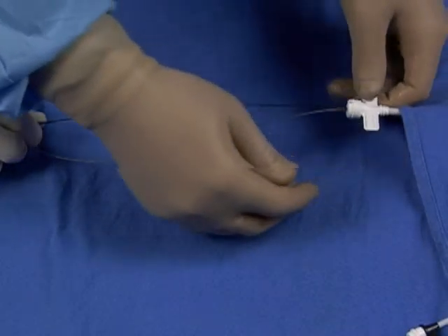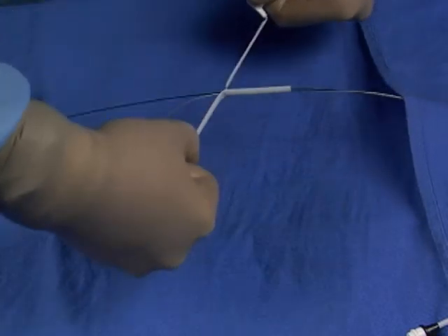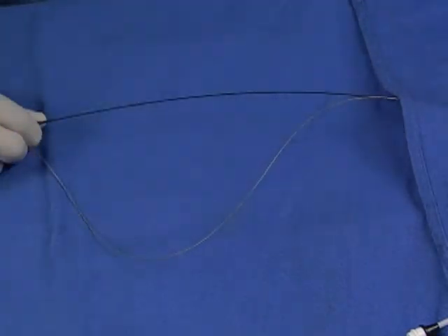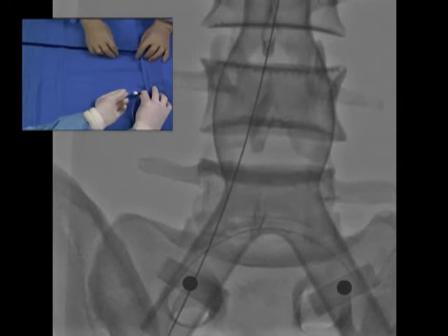Advance the delivery system to approximately 20 centimeters from the tearaway sheath, then remove, snap, and peel away the sheath while maintaining hemostasis. Next, advance the delivery system into the aorta while keeping the side port medial.